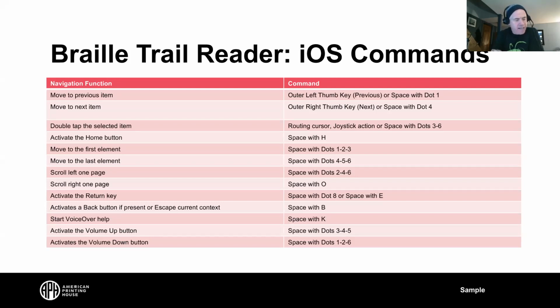What is the ideal number of Braille cells on a refreshable Braille device for your students? So we'll let those responses start to flow in, and I know there are some questions that we want to address. And folks, what I have up on the screen right now are some of the commands that we shared with you in the handout that Peter has gone through.